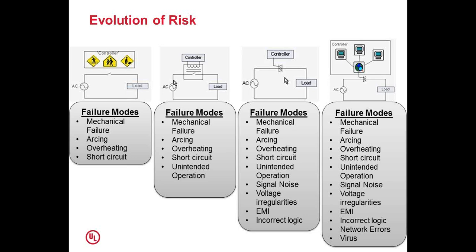So we can see clearly that as the product develops through the development and technology, we also see that there are more and more failure modes. Finally, we come to a controller where the person is not physically available and he is using the internet to connect the load. So here we can see, in addition to the previous ones, we can also come across network errors, virus attacks, and other things.